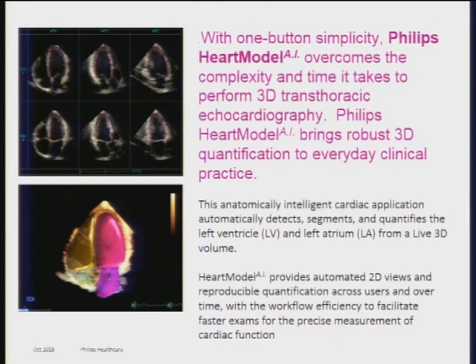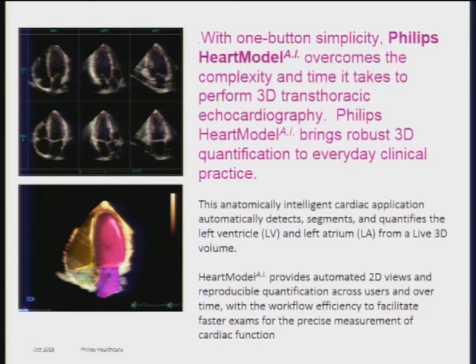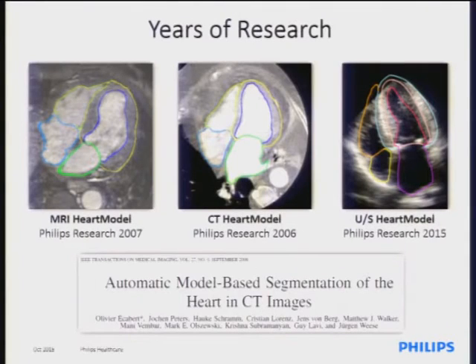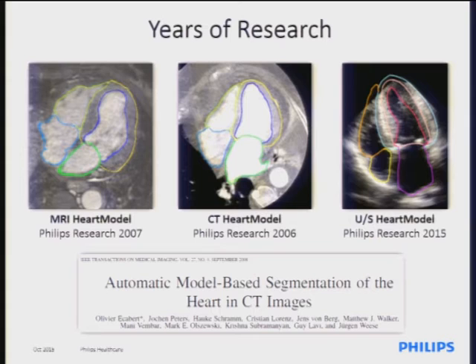With one-button simplicity, we overcome the complexity and time it takes to perform 3D transthoracic echocardiography. This tool automatically detects the segments and quantifies the left ventricle and left atrium. It also provides 2D views and reproducible quantification. Philips has a history of heart model research already used in MRI and CT, and this year we introduced our heart model for ultrasound.